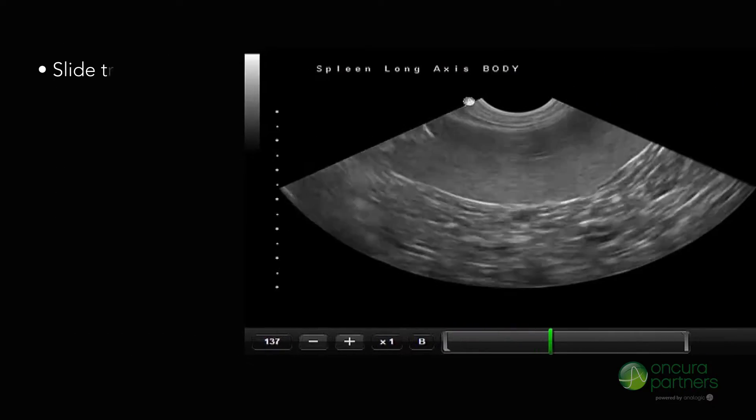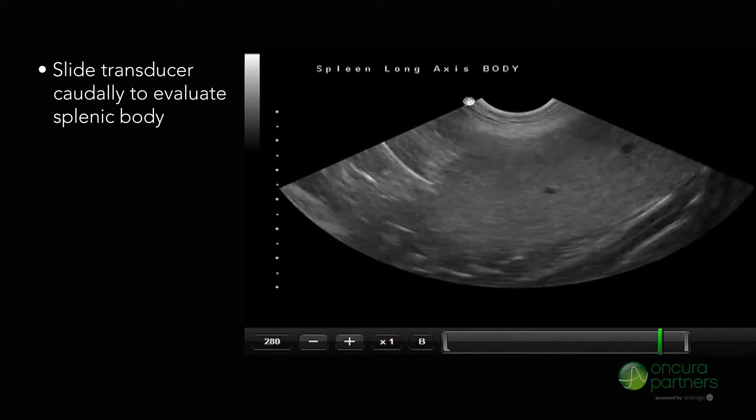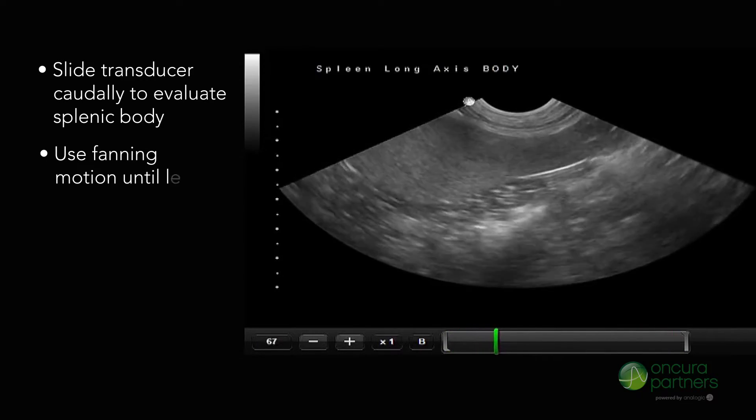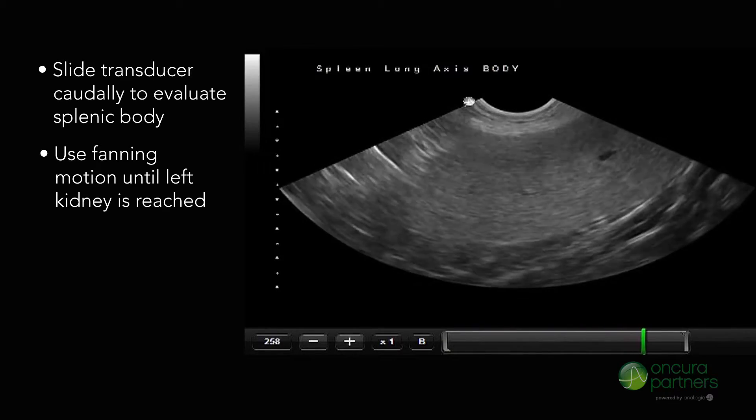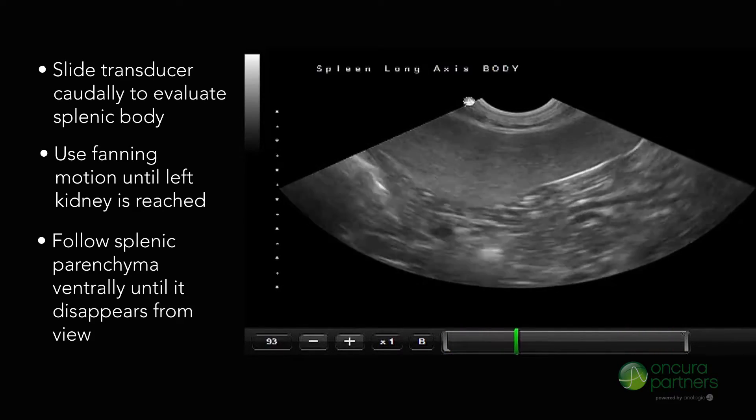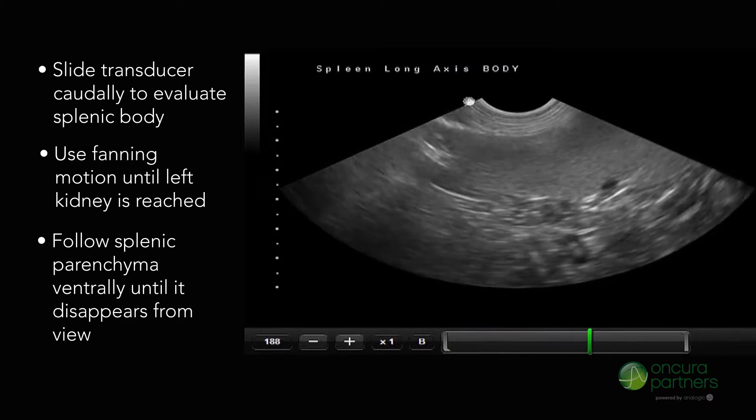Slide the transducer caudally to evaluate the splenic body using a fanning motion until the left kidney is reached. Continue ventrally following the splenic parenchyma until it disappears from view.